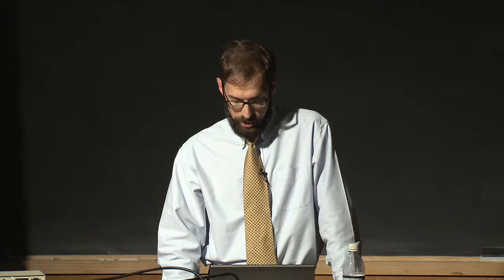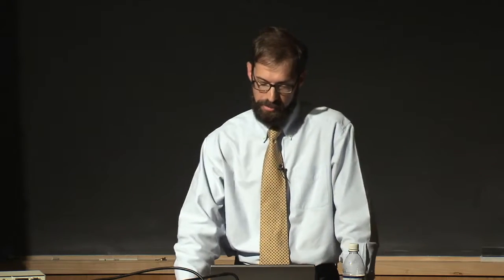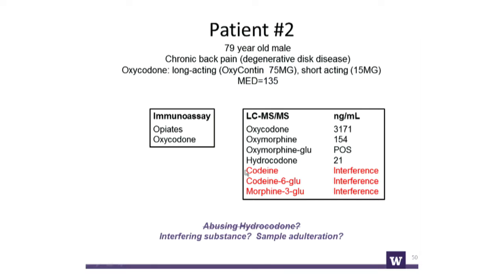These other problems, well, what about the codeine and the codeine glucuronide? What are all these interferences? Does that mean that they're pouring some soap into their urine before? I mean, he is 79. I doubt that that's happening. But how do we explain these things?